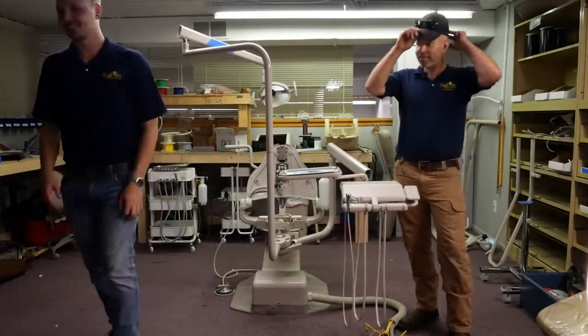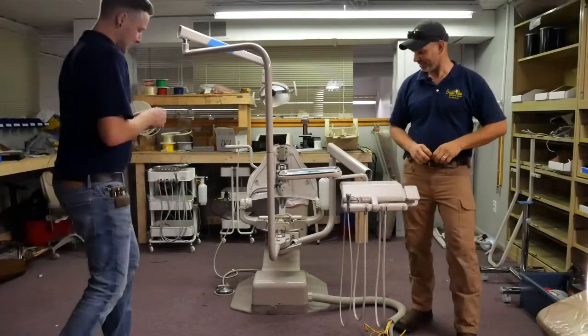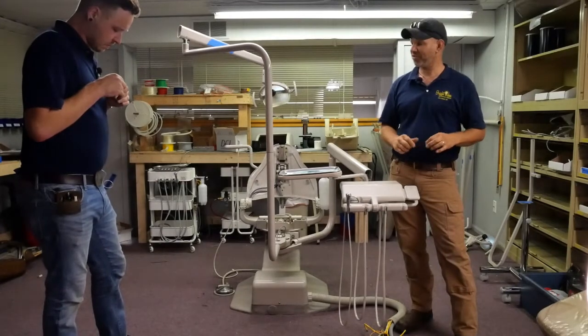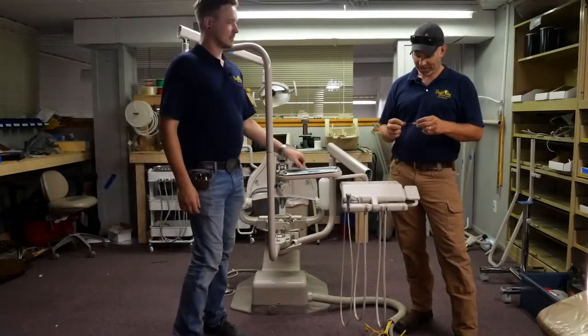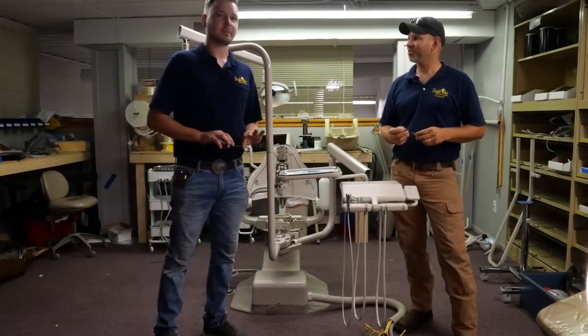Alright, well, I lost my Allen wrench. Got it. What's it gonna be? So you're just going to be that skilled. 5/32. Yeah, this is a 3/32, so we're rolling strong. In the 30-second game. Rolling deep in the 30 seconds.